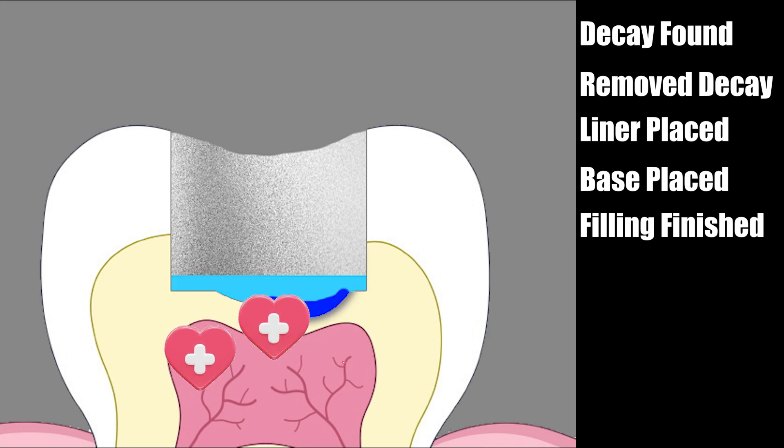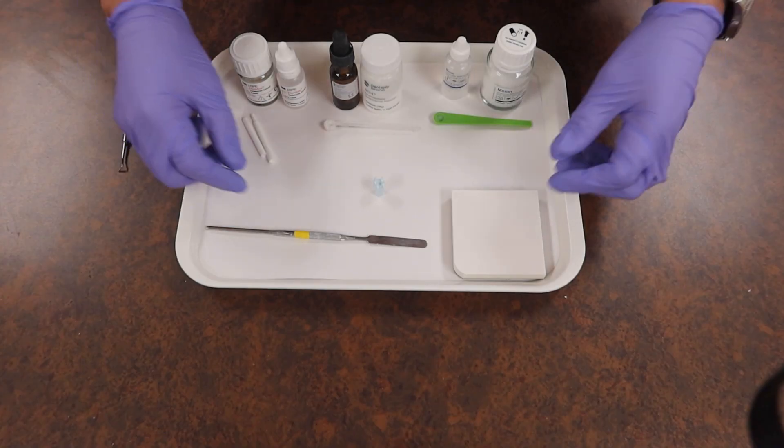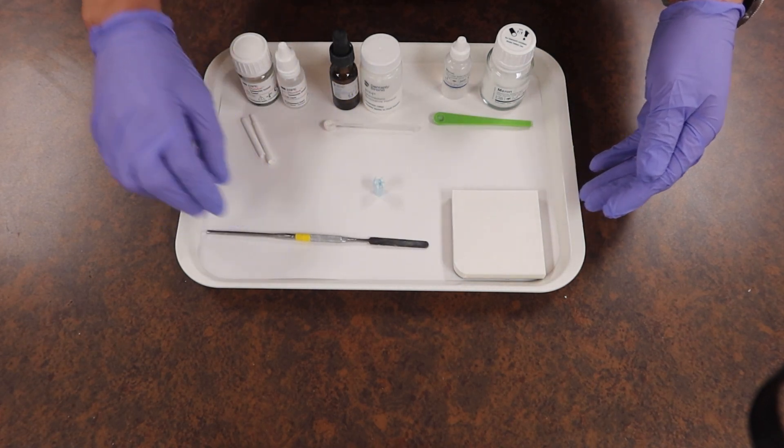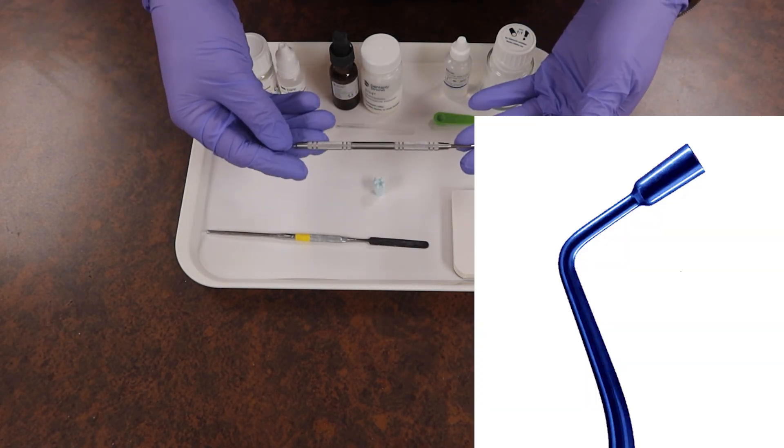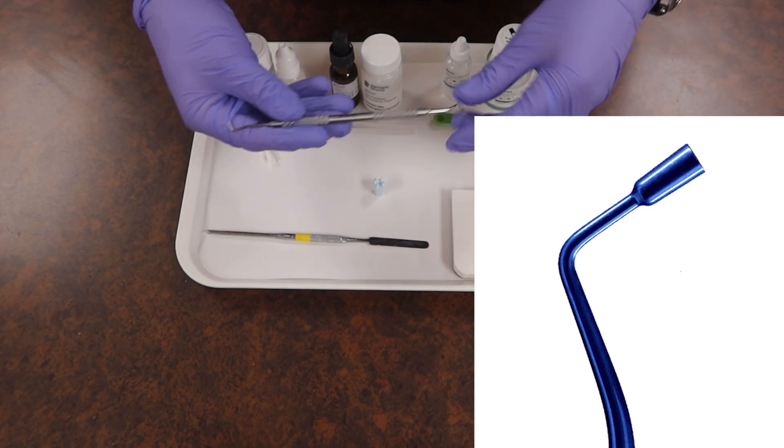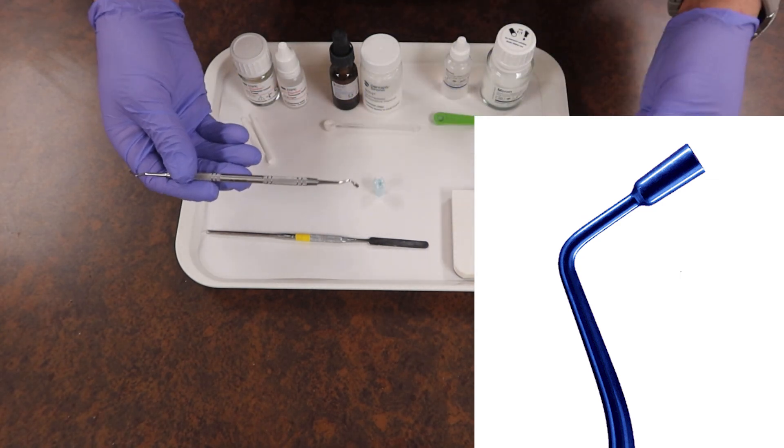With that, we still want to have our mixing pad, mixing spatula, and another special instrument on the side, which is going to be our condenser, because we are going to be using it at the lowest level where the doctor cut the tooth.